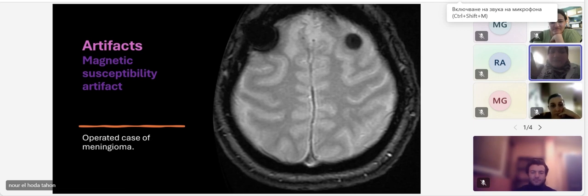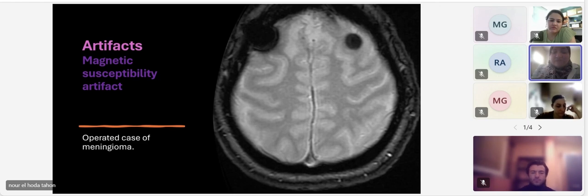Even we can write a paper about just artifacts in BraTS, because you collect images from different institutions, and maybe you have an artifact in FLAIR, maybe you have an artifact in SWI, but you don't have it in DWI, T1, T2 and the post-contrast. So you just share your images, but if you look carefully, you still have some deficiency in your images. And nothing is wrong about it, because anyone can share his images and didn't look at every single sequence.